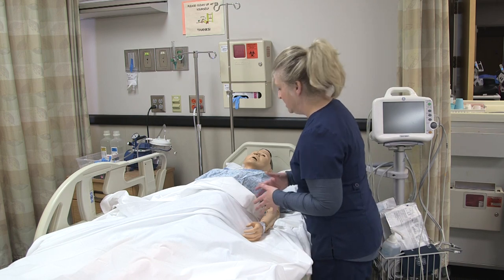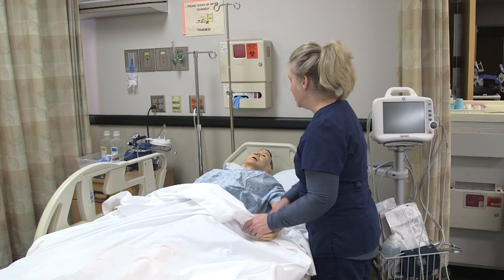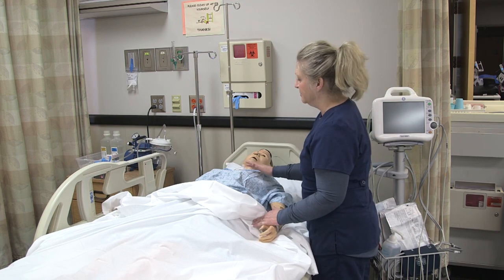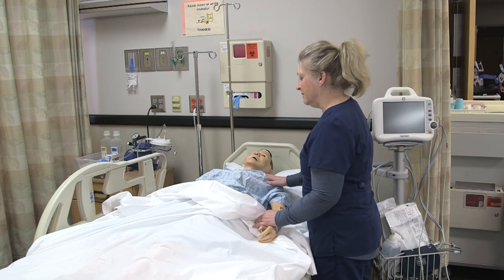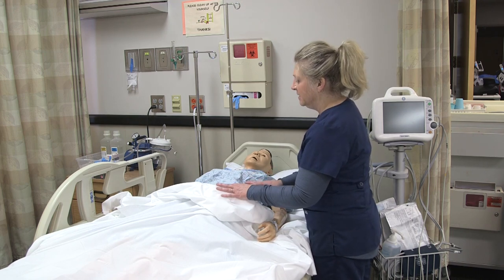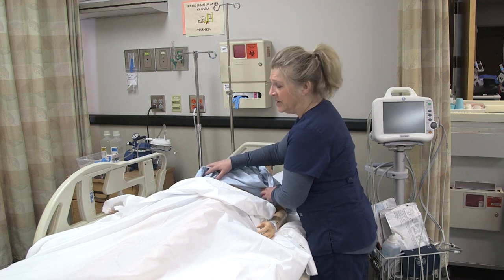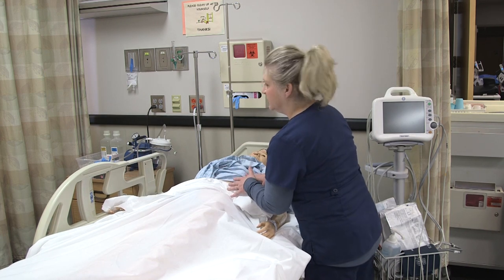I come in, I verify, I check allergies, everything verifies on the chart, and I explain to the patient what I'm going to be doing. The patient should be in a lying position because we're going to be putting the electrodes on the chest. If they can tolerate that, that would be the most appropriate position. Make sure that if there's any assessments such as a cardiovascular assessment that you need to do, that you do that prior to this. Then we're going to discreetly expose the patient's chest wall.